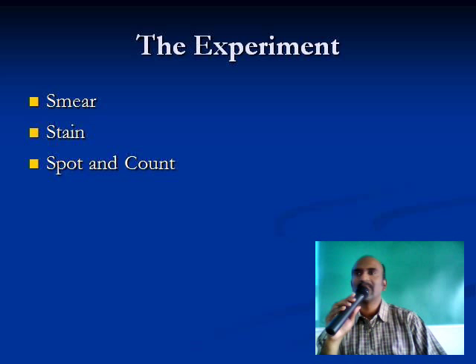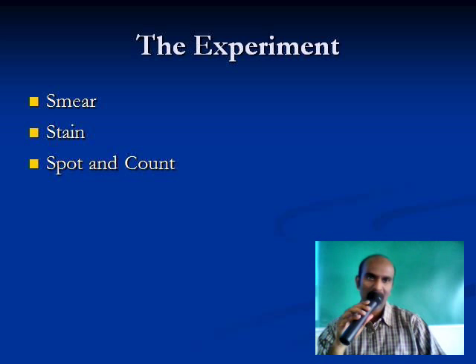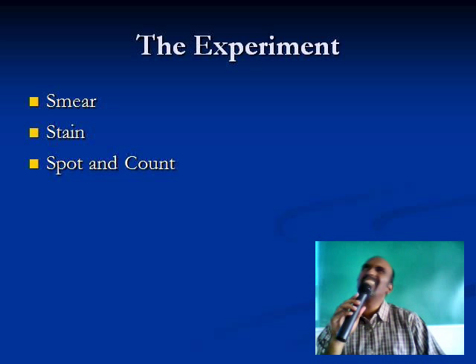What are the 3 steps? First step is to smear. Create a smear. That is the first step. Second step is stain.